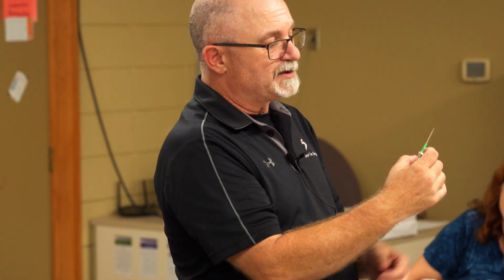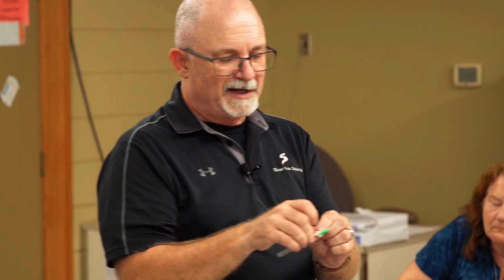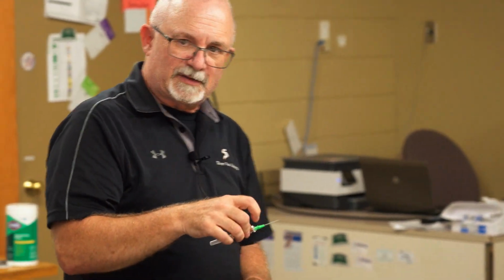So those are one of the big risks. The other one, of course, is infection. That's one of the other big ones. Infiltration can become a problem too. All right, so you've got your catheter. This one's green. There's your hub. When you pull it out, I like to do this real quick. Make sure that I'm not pulling it off, but just enough to break it. Occasionally when they come out of their package, there's still just enough of a connection that, ooh, it doesn't want to go.